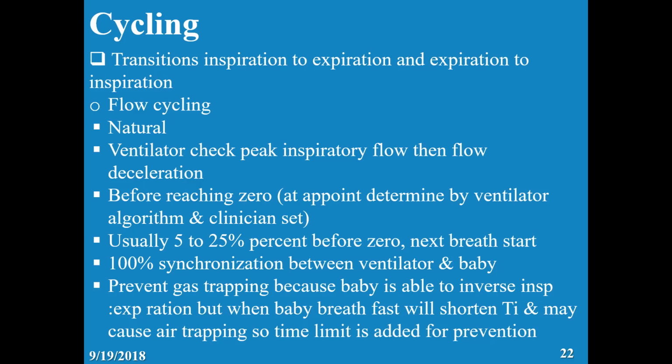And therefore, because of that, it's 100% synchronized. There is synchrony between the patient and the ventilator. And because of that, it's not controlled. The baby will never start before it goes to zero, because it measures the remaining, and therefore it will never have air trapping. Because remember, in time cycling, it's regardless of what the patient wants. There is time that needs to be finished before the transition happens.